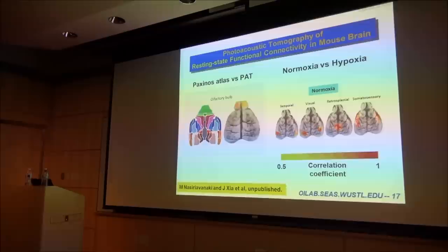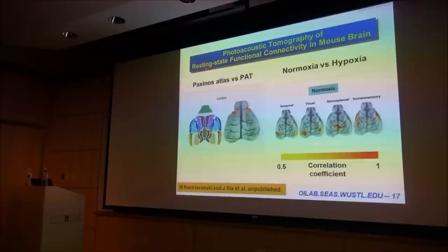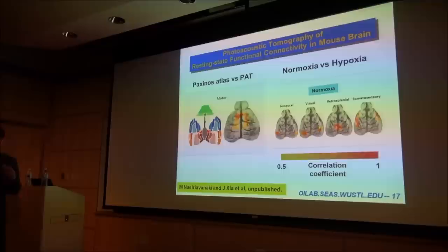Recently we applied this for brain imaging. We're trying to map the resting state functional connectivity. So you're not stimulating the animal in any regard. You just let them sit there. Of course, they're under anesthesia. You can see the correlation between different maps we've identified.